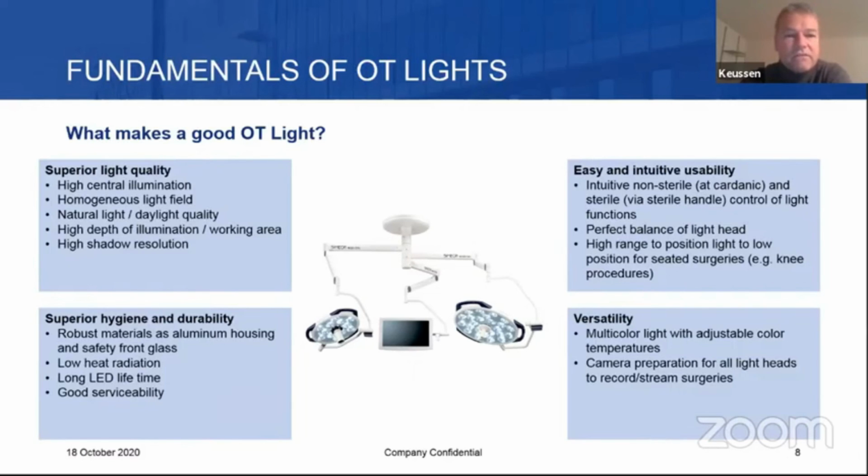Last but not least, good serviceability, because you require 24/7 availability of the light, also for procedures that are not planned. And lastly, versatility. What we see in the market is multicolor lights, where you can adjust the color temperature of the light according to personal preferences and the procedure.